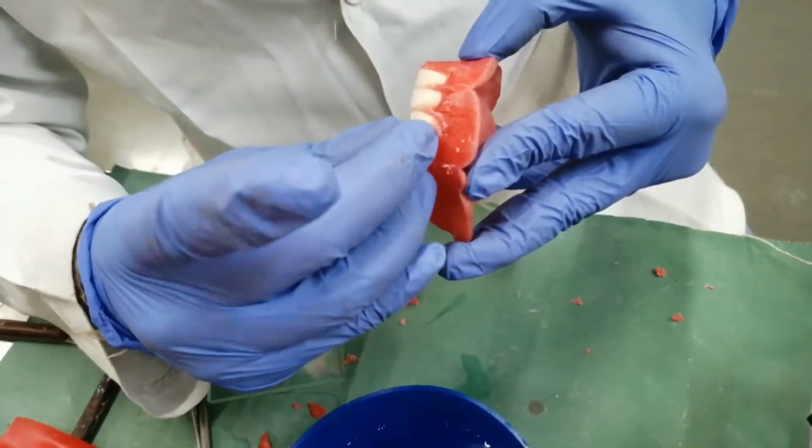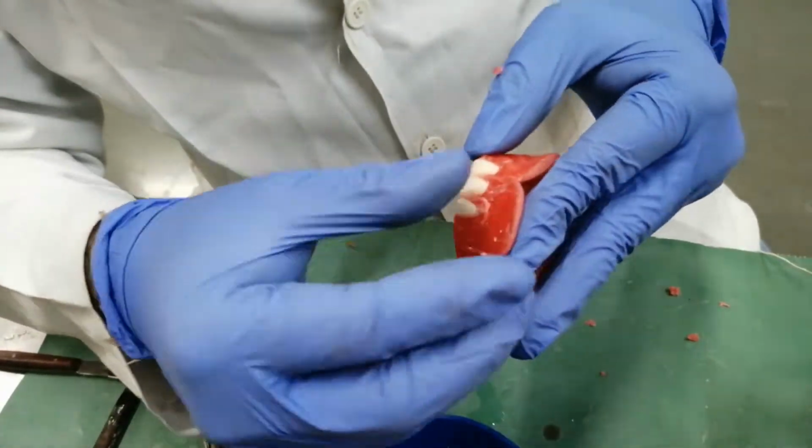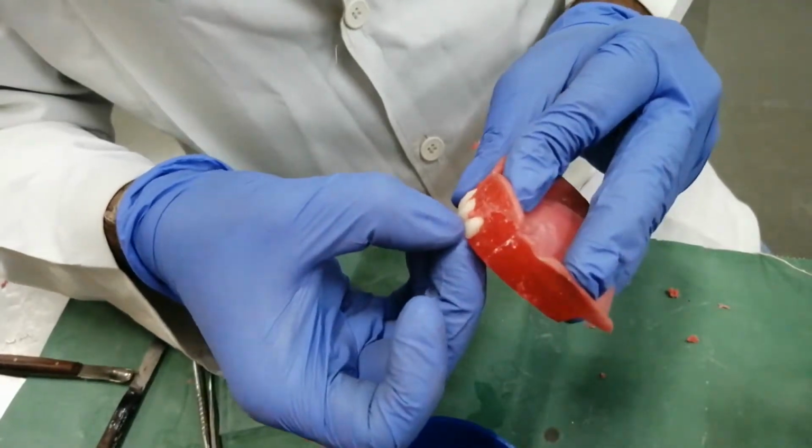Now we have placed the lateral incisor and we are arranging the inclinations.